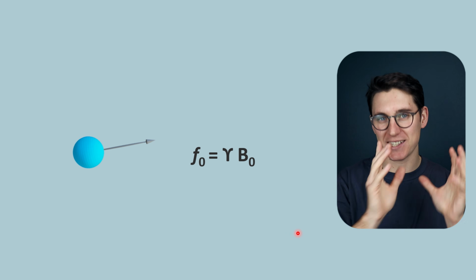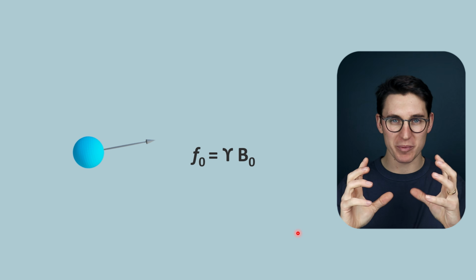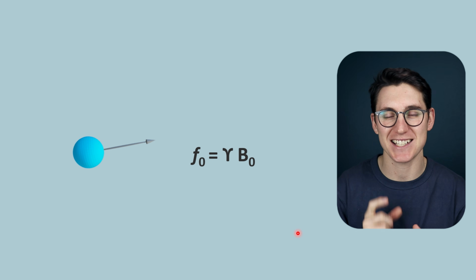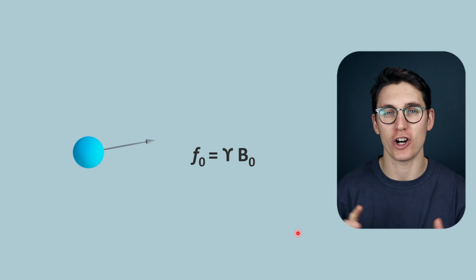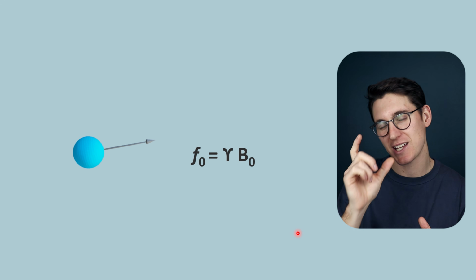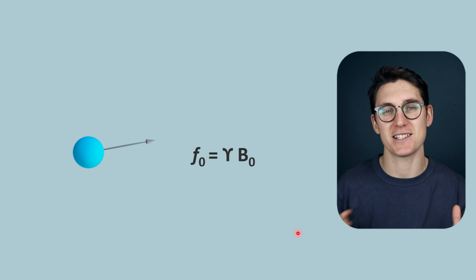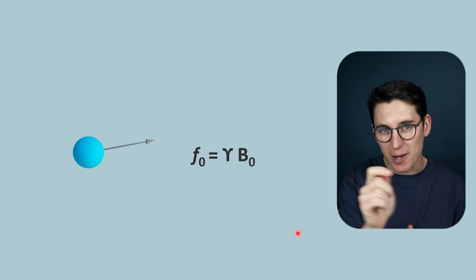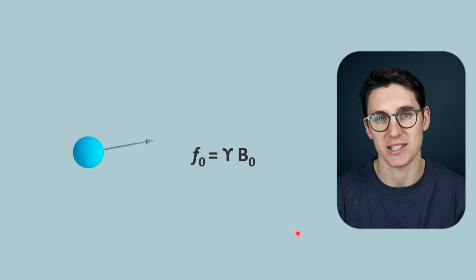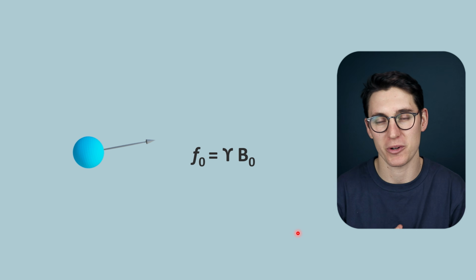Today we're going to be looking at chemical shift and the chemical shift artifact. Now up until now we've been thinking about hydrogen atoms in isolation, unbound to other atoms and not forming parts of larger molecules. And we've seen that because the hydrogen atom has a non-zero spin, if we were to place it in an external magnetic field, it would align with that magnetic field and precess at a specific frequency. And we can calculate that precessional frequency using the Larmor equation.